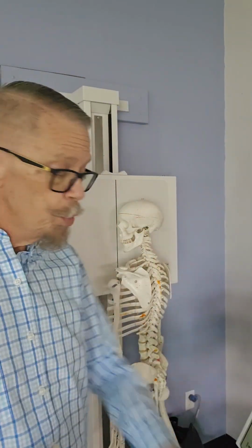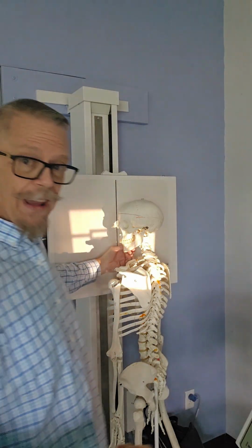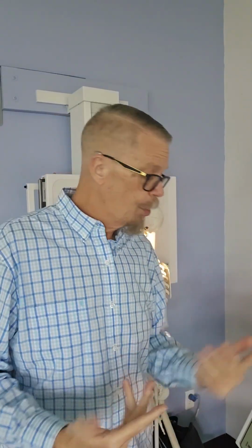What we're trying to do with the angle is get, in this case, the patient's left side of the mandible good without superimposing over the right side. And then when we do the opposite side, we do the same thing. We would just turn the patient the other way, keep our angle, depending on the patient. Sometimes you don't need to do that tilt.